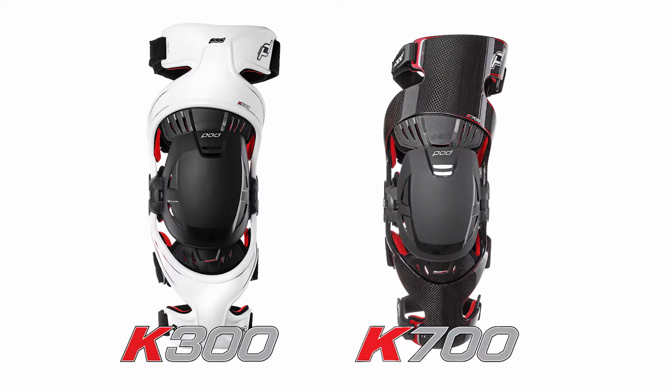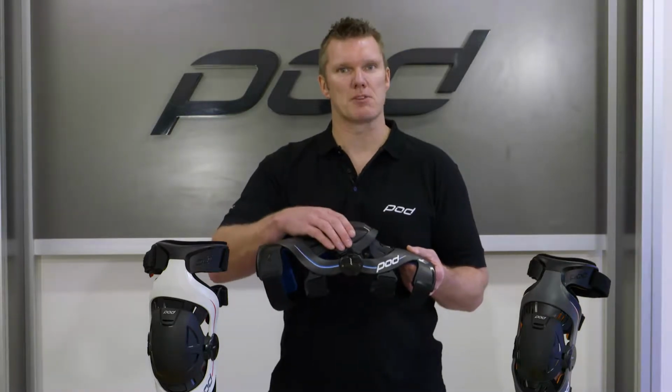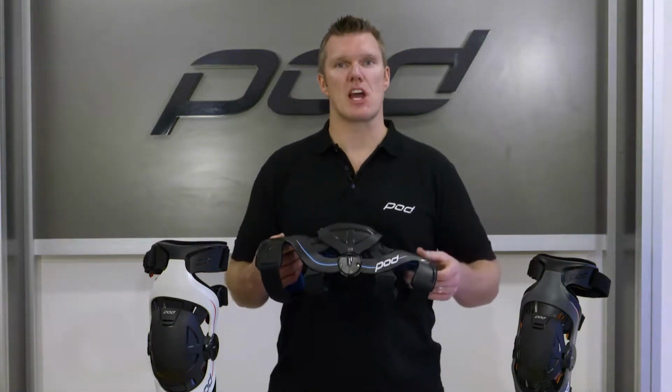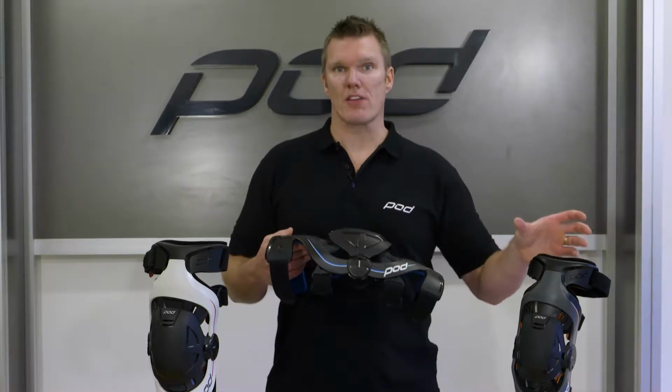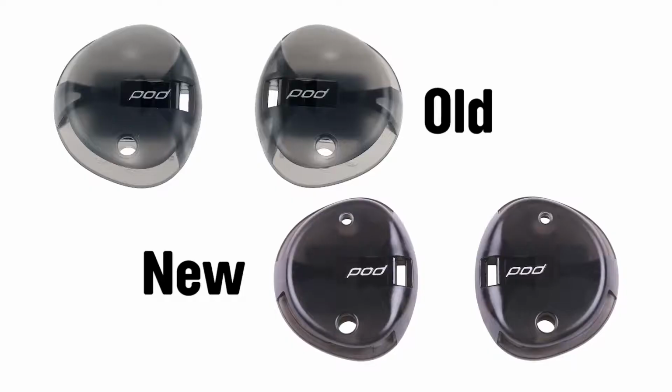and ligament. If you're actually using the older K300 or K700 brace, then you actually can move to the new hinge housing, though you will have to replace the patella cup as well. We made some updates and changes from the K300, K700 to the new 1, 4 and 8 hinge housing. You'll note the new hinge housing has 2 holes.